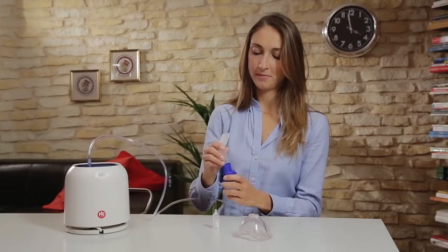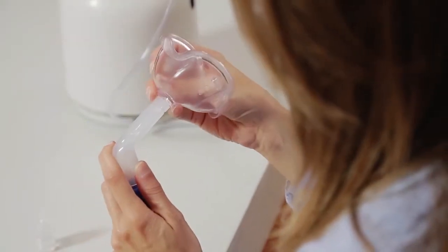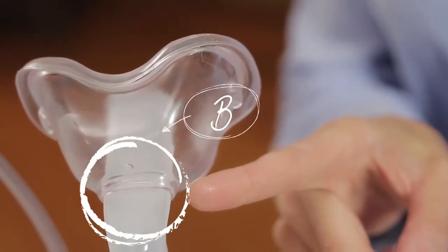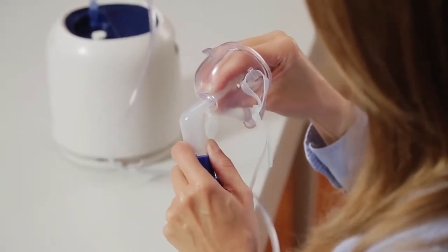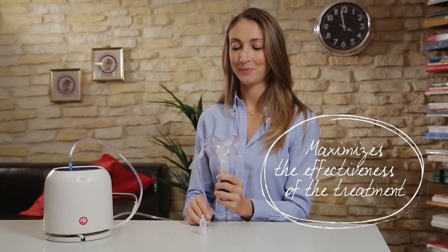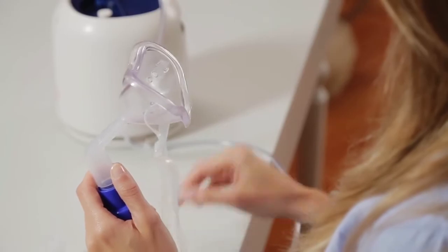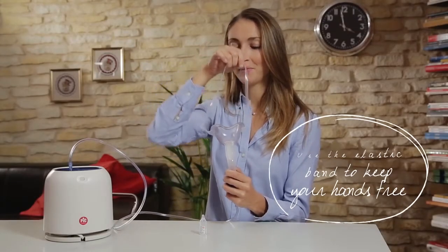Take the mouthpiece and the two-in-one face mask. The mouthpiece has two different notches on which you can position the mask. Slide the mask until it reaches the second notch, so to deliver the medication directly to the airways, maximising the effectiveness of the treatment. Choose the first notch for a traditional use of the mask. Adjust the elastic band to secure the mask on your face, if you want to keep your hands free during the treatment.